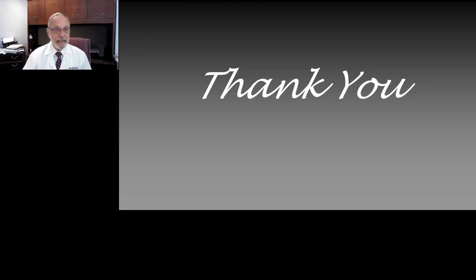Thank you. I think the final comment is to try to spread the word that PTH assays are heterogeneous, and try to know which assay is being used. If you can influence it, try to have the labs say which PTH assay is being used, and on our end we'll try to continue to work towards trying to achieve standardization of PTH.